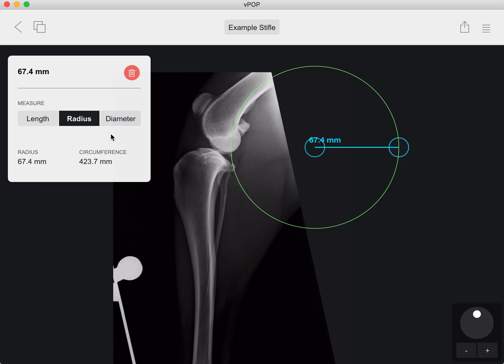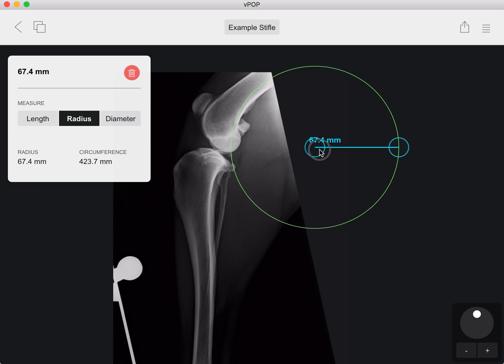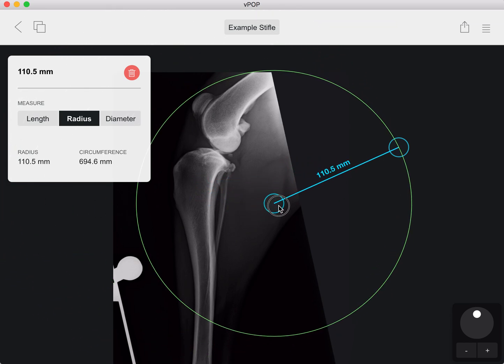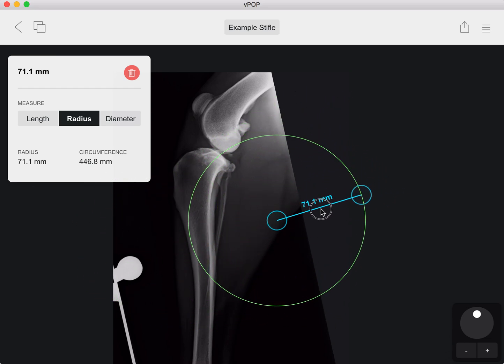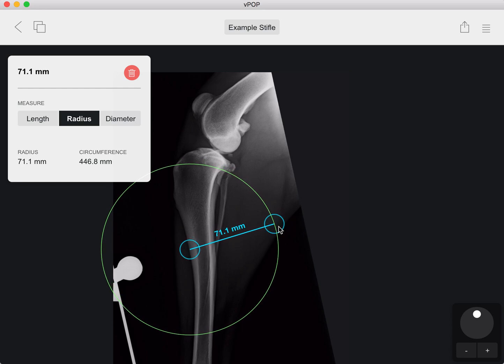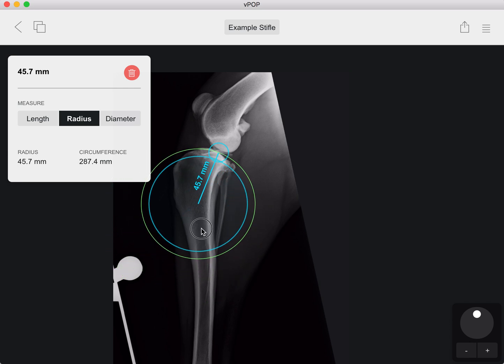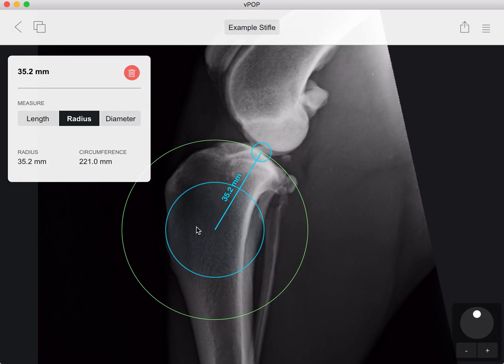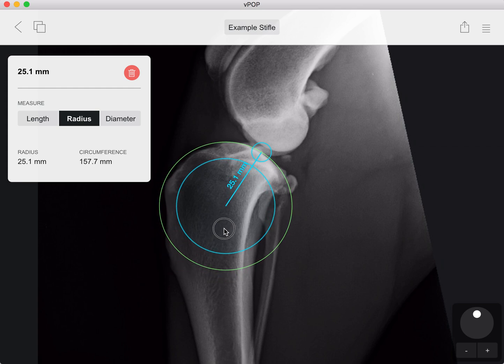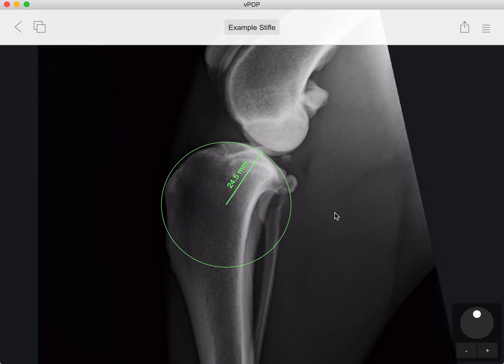By clicking on radius or diameter we have various options we can scroll through. We're going to go to radius to start off with, and you can position the centre of the circle wherever you want to. You can also move the circle around the screen by clicking on the line. We're going to go to the edge of our tibial plateau, zoom in to get better clarity, and move in to approximate the curvature of our tibial plateau. Once we're finished we can just click outside and there we have our line.